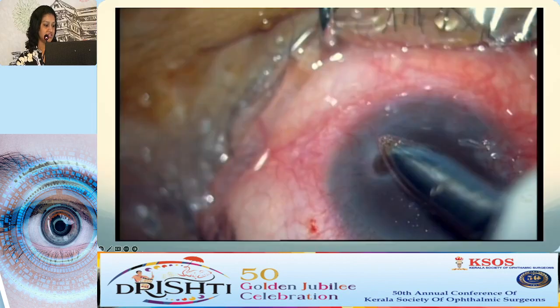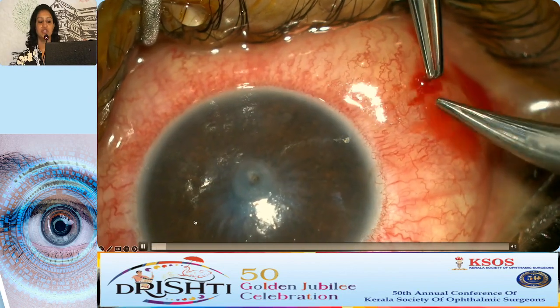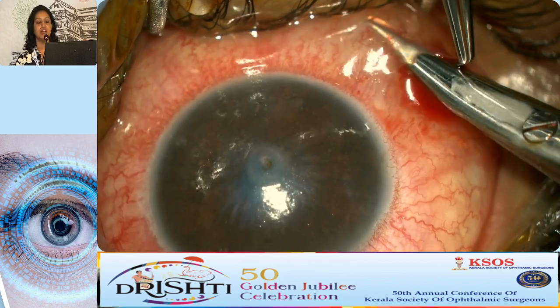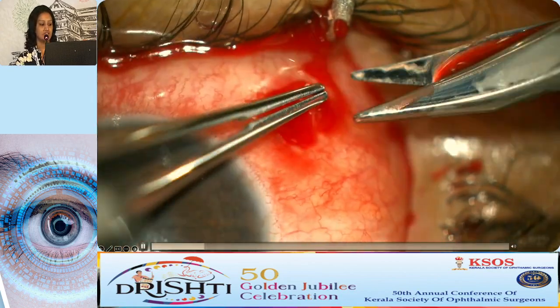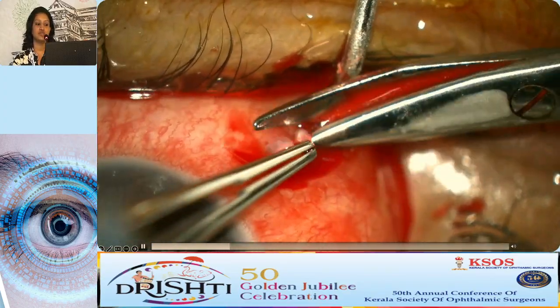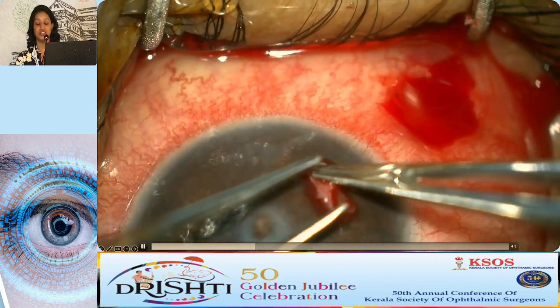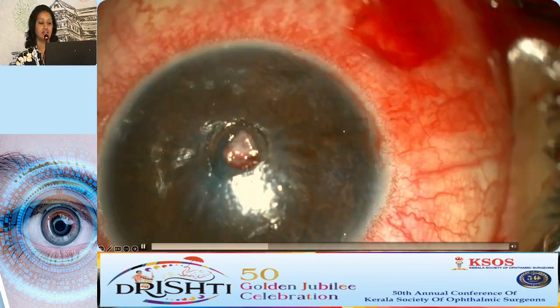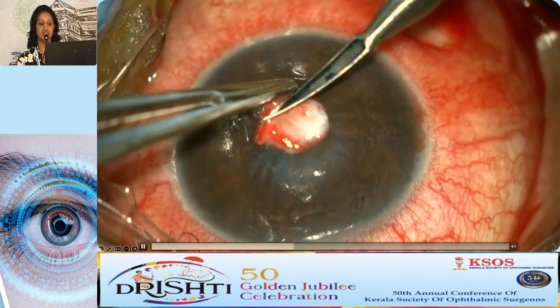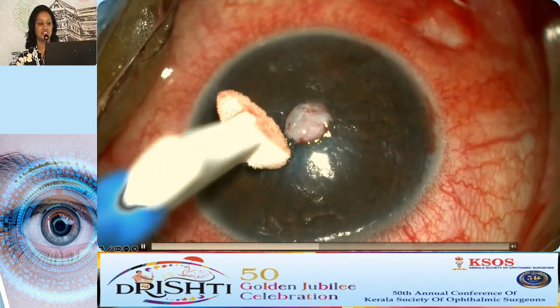So it is a simple surgery where after inducing a chemosis on the superior, you resect the conjunctiva and extract the Tenon's graft underneath. Like how sir mentioned in a pterygium, you would avoid including a Tenon's. In this case, you would actually extract a piece of the Tenon's. After drying the surface, and if you want to seal it better, you'd use a fibrin glue, and you can trim it to the size needed.